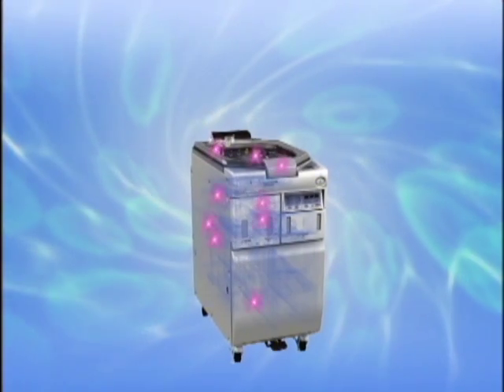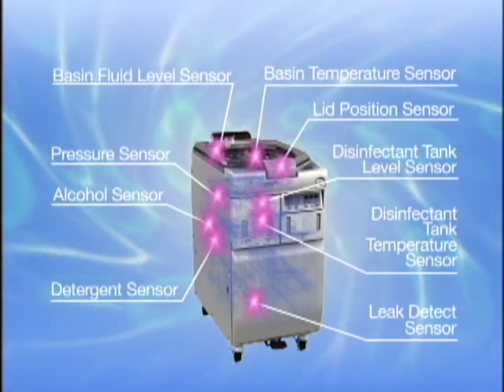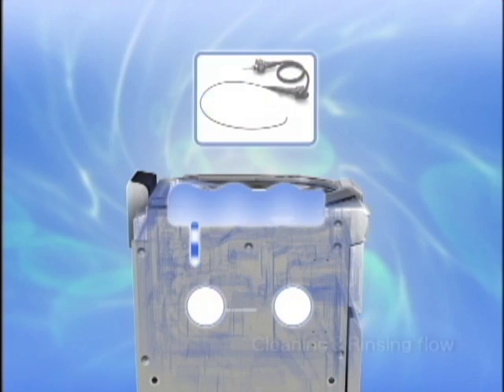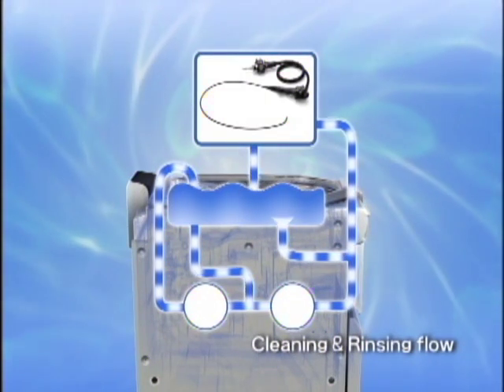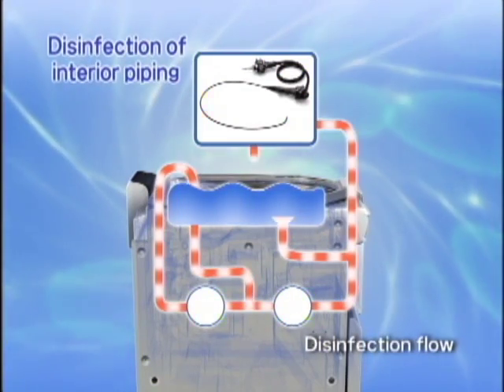Yet another measure to enhance reliability is the incorporation of sensors in various sections of the OER Pro that detect and warn you of any abnormalities. Moreover, as the scope is reprocessed, the piping where cleaning solution and rinsing water flow is also disinfected.